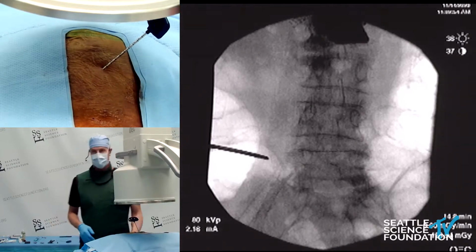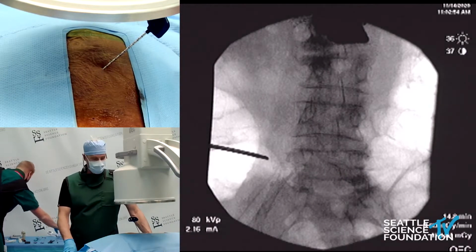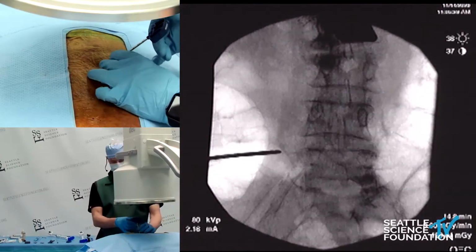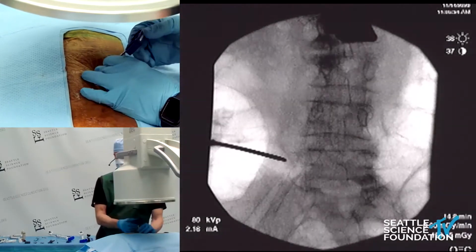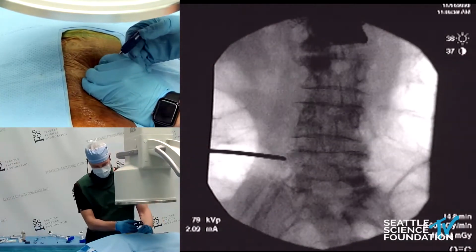So we're going to take two systems and put them through the paces. One is the new Arcadia balloon by Merit, and then after that we'll take a look at SpineJack made by Stryker. And so we will access L5 here. So we're starting off with the Arcadia system, and we'll come down effectively starting at about 9 o'clock.